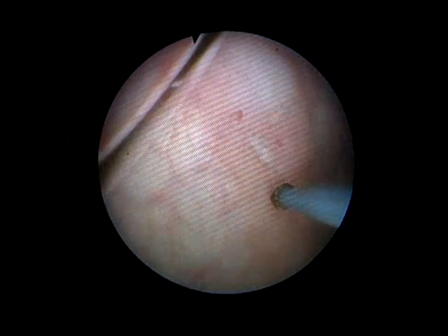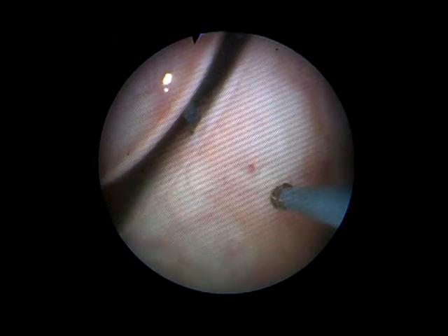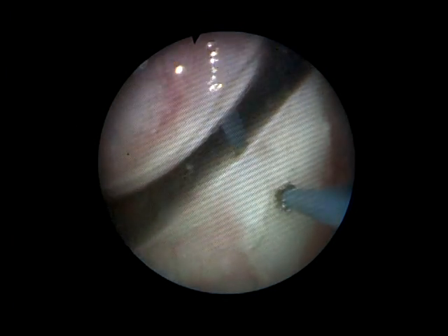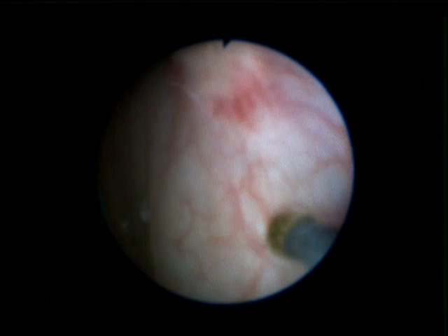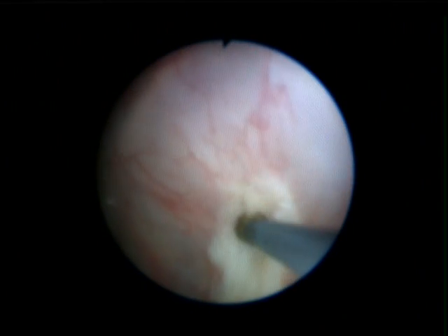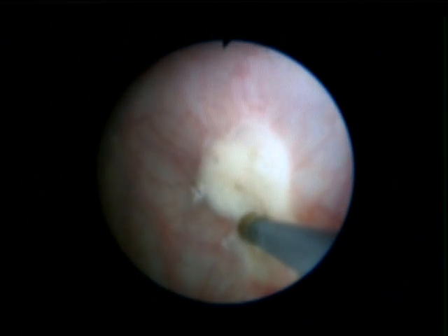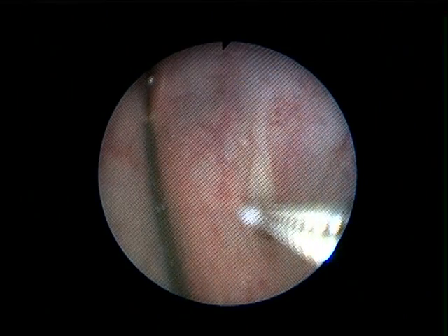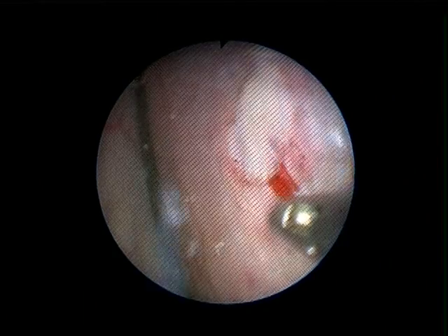The Bugbee electrode was used to diathermize the area of the planned opening in a vertical manner. The previously instilled glycine made it possible for the diathermy to work properly. After the diathermy was done, the bladder was emptied and 100 cc's of normal saline was instilled.